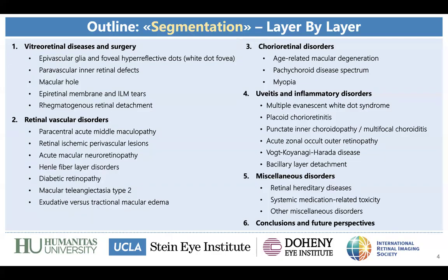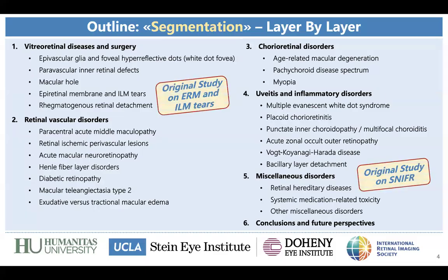To keep it more interesting, I will also speak about two recent original studies that we've published using en face OCT in epiretinal membrane and in the second study.